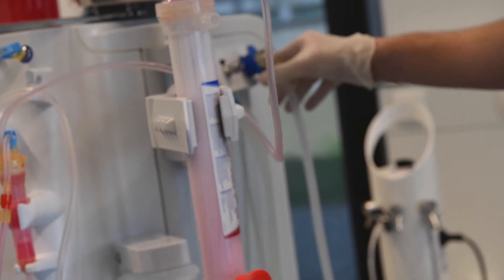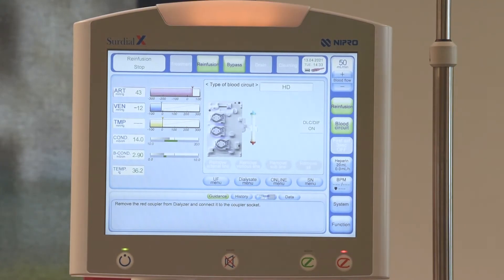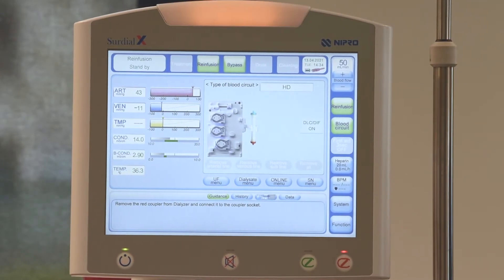Follow the screen prompts and attach the blue dialyser coupler to the coupler socket. After the dialyser has been emptied, connect the red dialyser coupler to the coupler socket.